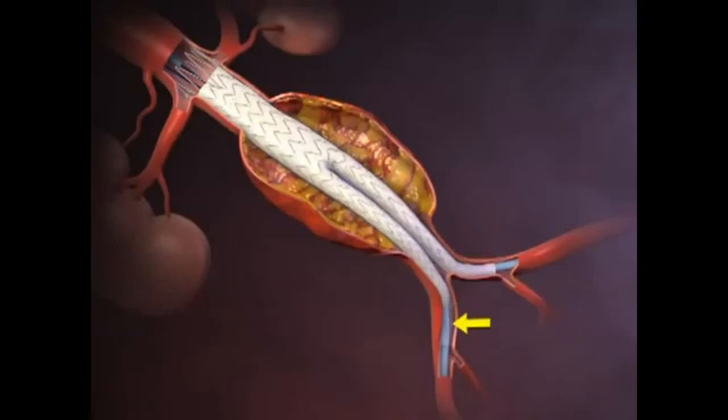The ipsilateral limb of the stent graft is deployed in similar fashion. A balloon is then introduced and used to expand all graft-to-vessel and graft-to-graft junctions in the proximal to distal direction to ensure a tight seal. Finally, the sheaths and guide wires are removed and the femoral arteries repaired. Aortic blood subsequently flows through the stent graft.